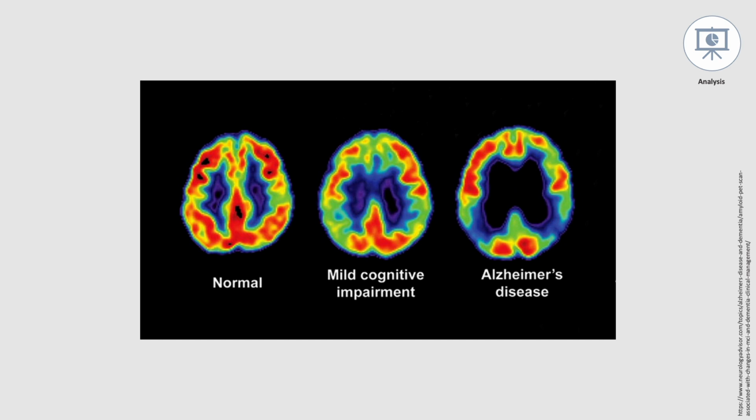Alzheimer's causes the hippocampus, the part of the brain responsible for memory, to shrink, leading to difficulties remembering things. The PET scan was done to find out if there were any amyloid beta plaques, a typical feature of Alzheimer's disease, in the brain. The darker regions of these brain scans are where there is plaque, and therefore no metabolism of the brain cells in those areas.